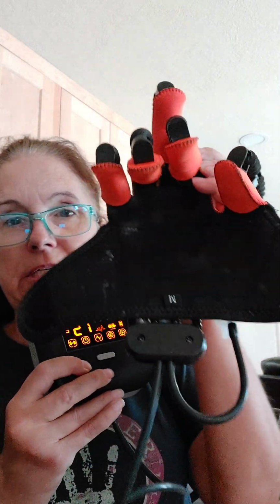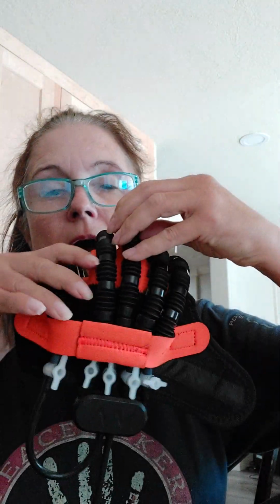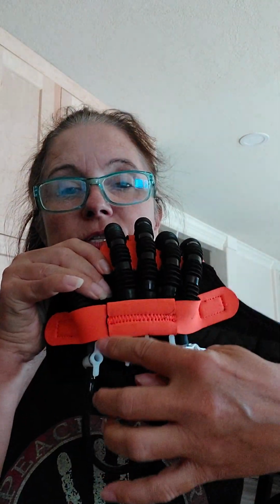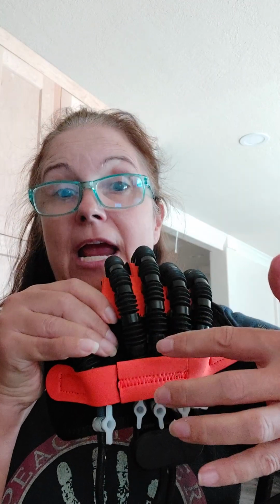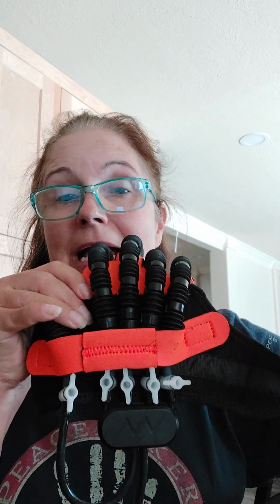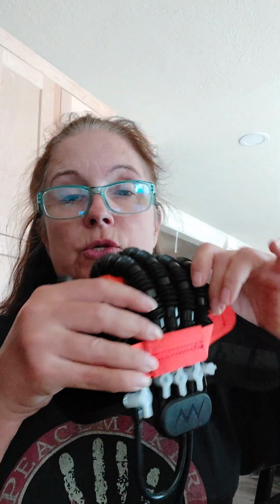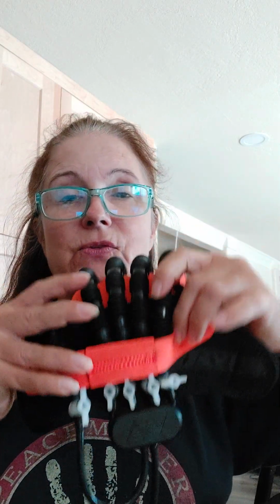Now, what I want to show you about the hand robot, you just stick your hand in, and what I like about this brand is it's got cutoffs, okay? So if this is like this, it's air powered, right? The air is coming through. This one, I have to leave shut off. Frankly, I don't even put my hand in there because that finger's toast, right? So that's how that is.